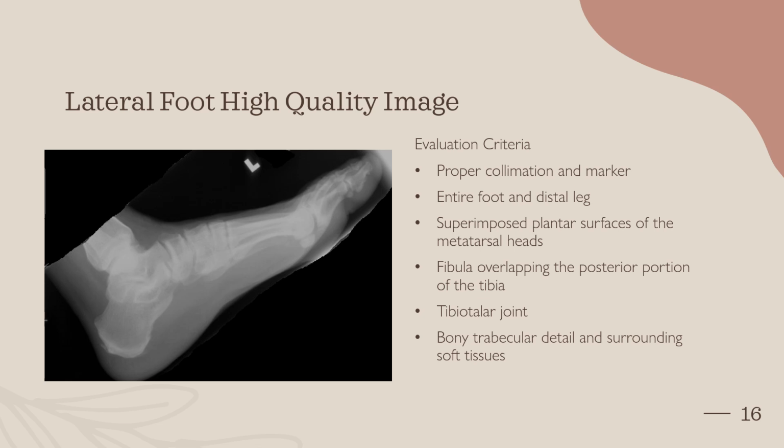Lateral foot high quality image. So we're going to have proper collimation and marker. We're going to have the entire foot and distal leg, superimposed plantar surface of the metatarsal heads, as we can see here. Fibula overlapping the posterior portion of the tibia, so we can see that right here. Their tibiotalar joint, and then bony trabecular detail and surrounding soft tissue.